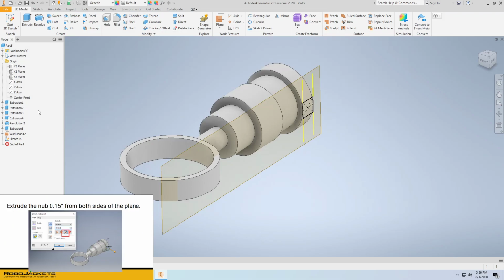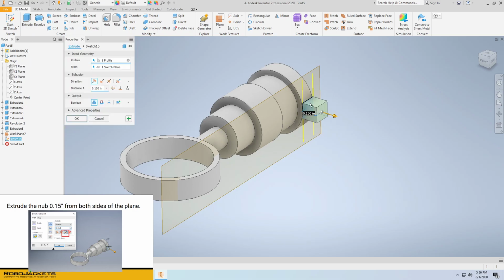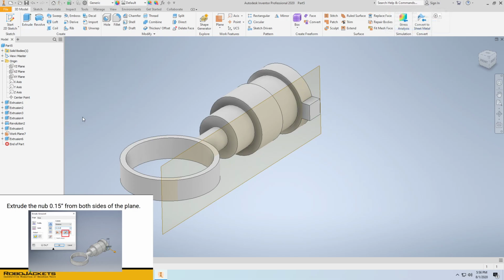Now we'll extrude this to create the nub we wanted. Selecting the extrude tool, select this profile. We will actually want it to go both ways. So select the both directions option. And we want a constant thickness. So let's go ahead and enter in 0.15 and hit OK. So here's our nub.